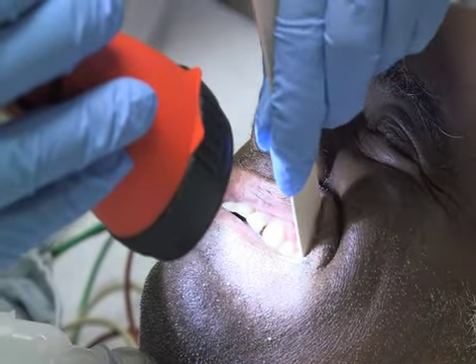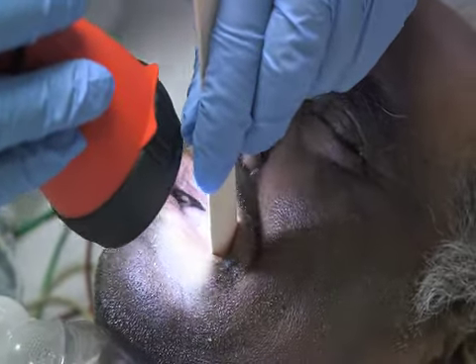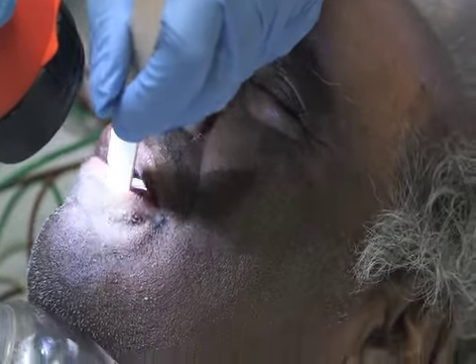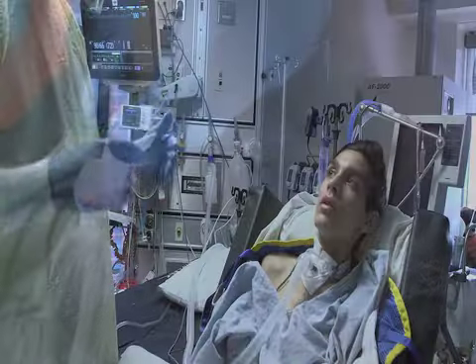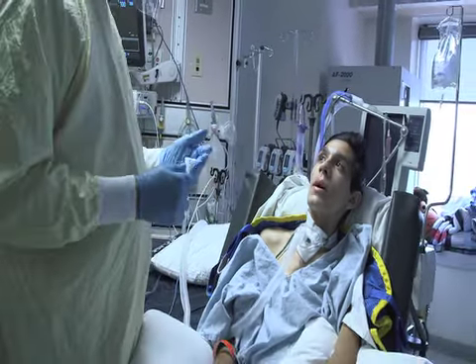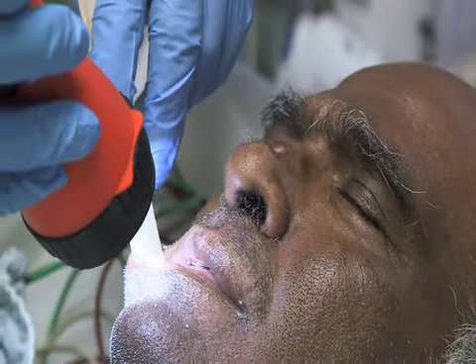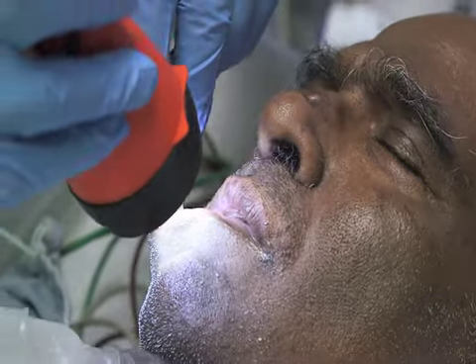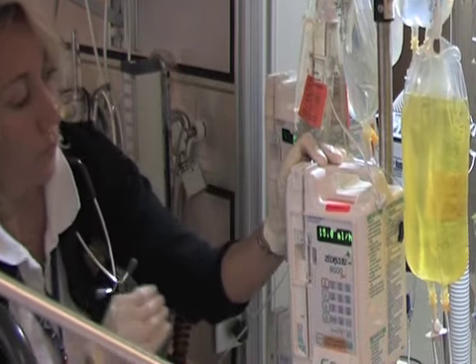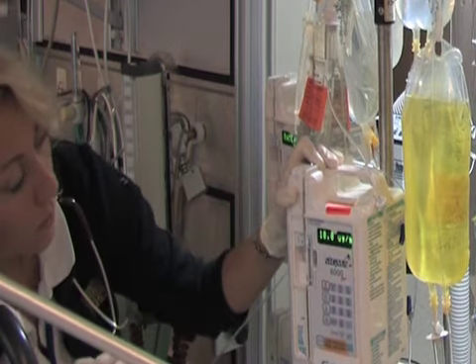Look for changes in color, presence of swelling, redness, ulceration, and any dry or malodorous areas which may indicate the presence of bacteria. If the patient is able to self-report, ask about oral dryness and pain in the mouth or throat. If the patient is unable to tolerate the examination of the oral cavity, evaluate for pain presence and provide analgesia before moving on to the next step of comprehensive oral care.